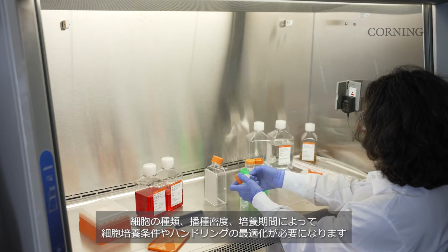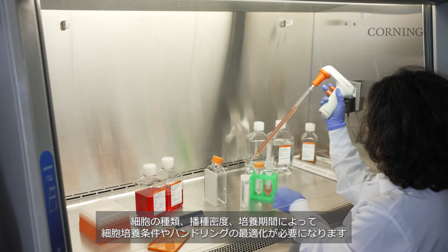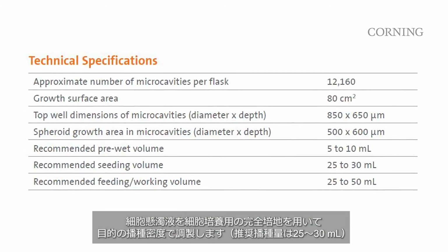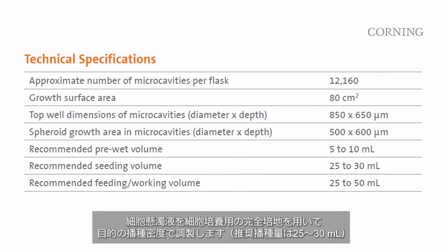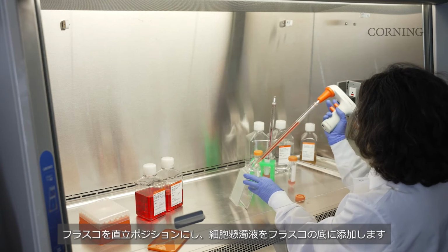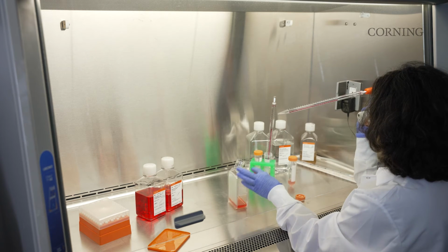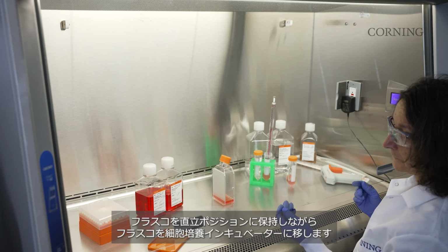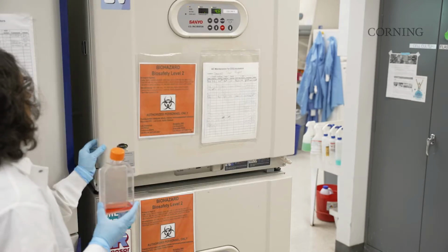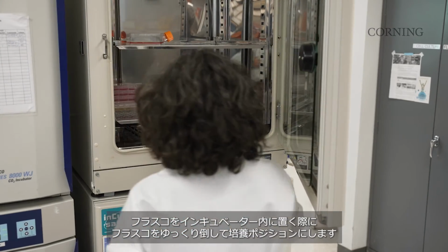Some optimizations of cell culture conditions and handling will be required depending on cell type, seeding density, and desired culture time. To seed the cells, prepare cell suspension at the desired seeding density in 25 to 30 milliliters of complete cell culture medium. Place the flask in the upright position and dispense the cell suspension to the bottom of the flask. Keeping the flask in the upright position, transfer the flask to an appropriate cell culture incubator.